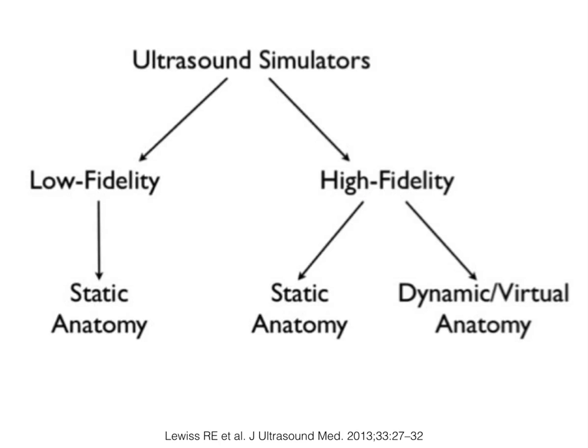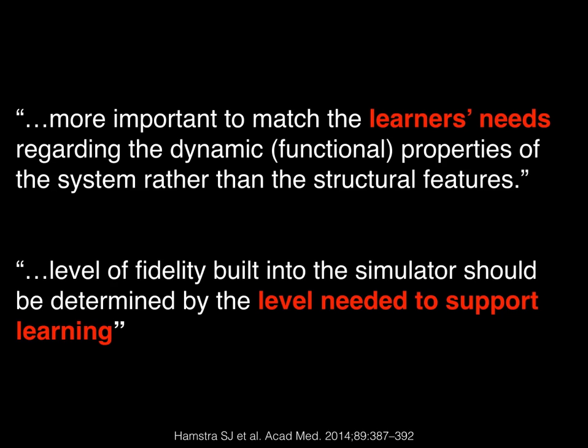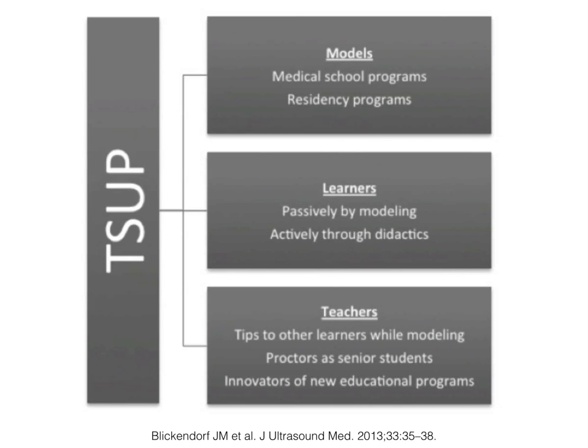Now, when we talk about ultrasound simulators, there's this discussion about low fidelity versus high fidelity, static versus dynamic. And what's a greater focus, and Hamstra brings this up, is that instead of focusing so much on the fidelity, focus on what you need. What does the learner need? And that's the much more important clarification of that simulator. You need the level of simulation to support the learning.